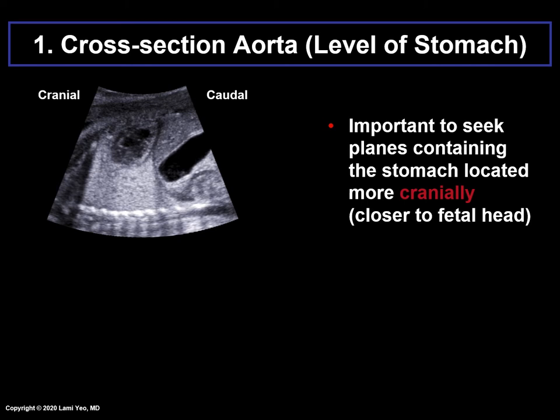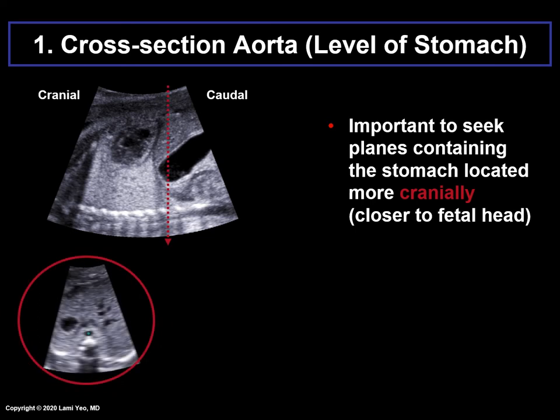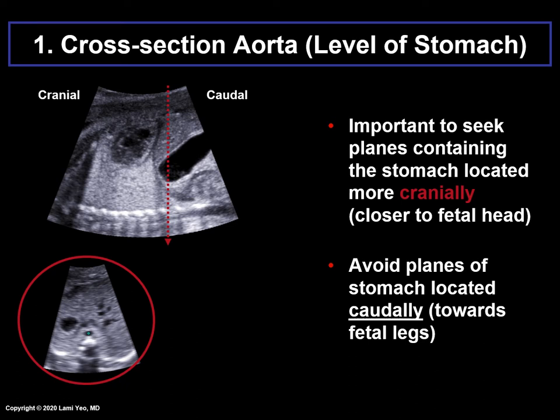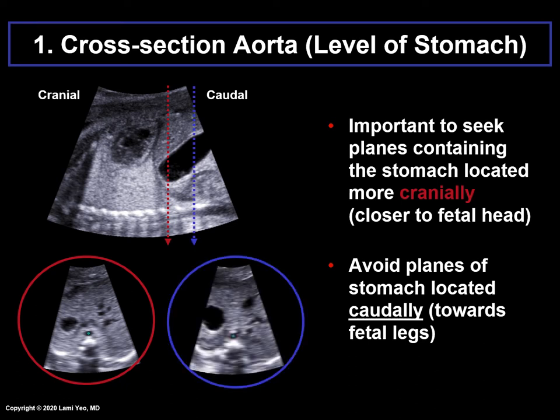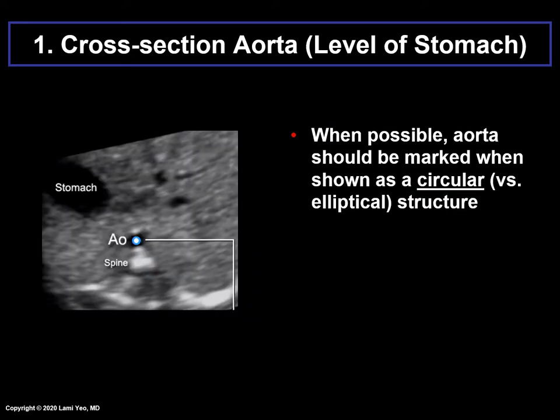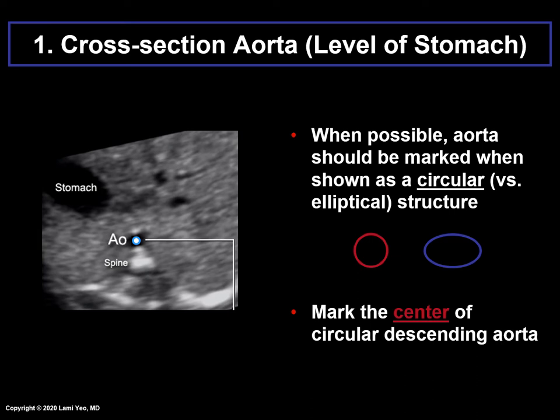It is important to seek planes containing the stomach that are located more cranially, closer to the fetal head, and avoid planes of the stomach located caudally towards the fetal legs. Also, when possible, the aorta should be marked when it is shown as a circular versus elliptical structure. Then mark the center of the circular descending aorta.